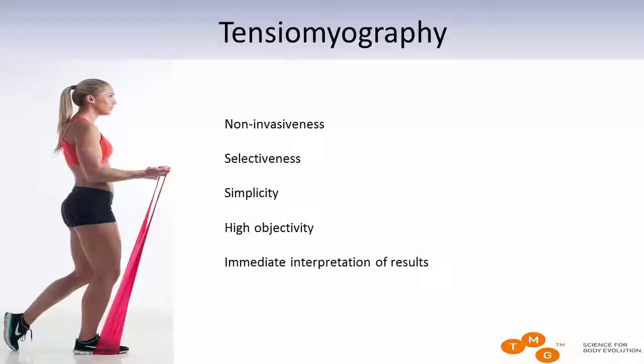Okay, so these are just some of the benefits of the TMG as we see it. It's not invasive, so that means that you can do the measurements immediately after the muscle was injured, and you will not create additional damage to the muscle. You can do the measurements before training. You will not create fatigue.